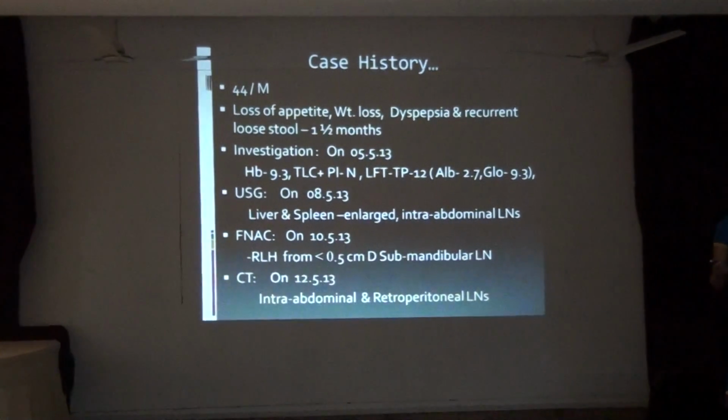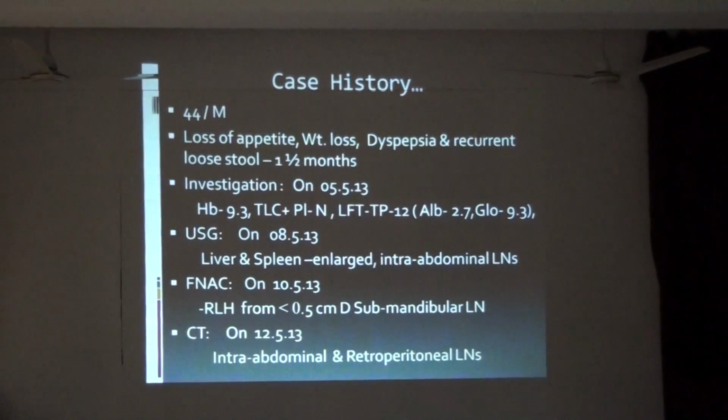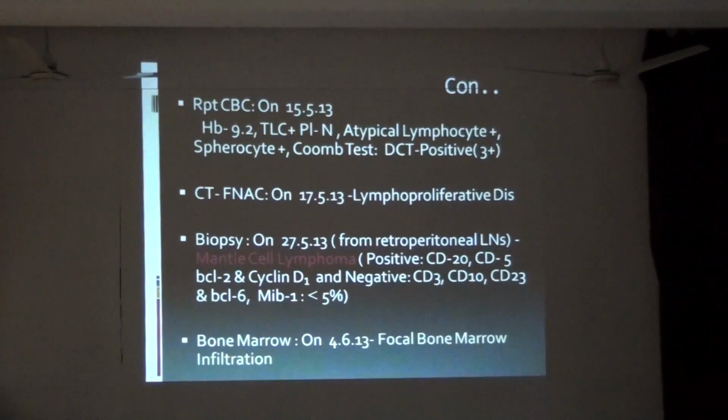is highly suggestive of tuberculosis. But if you see carefully on the peripheral smear in this case, unless you have the diagnosis in mind, only then can we see the peripheral smear with that angle. Otherwise, we are not going to see at all. Unless your mind knows, you cannot see it. This is called so in pathology.